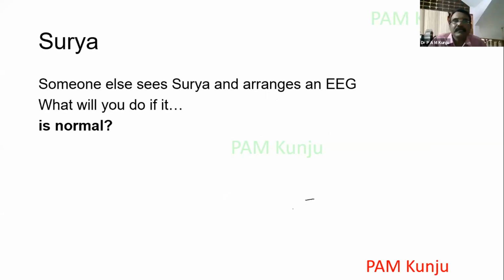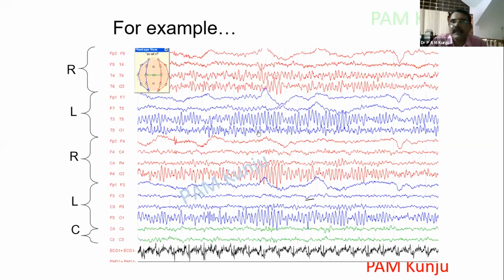But anyway, here the EEG is normal, and it was done at that time. You see that EEG, it may be reported as abnormal, because we can see there are a lot of high amplitude discharges. But these are all normal. So this is a normal EEG.